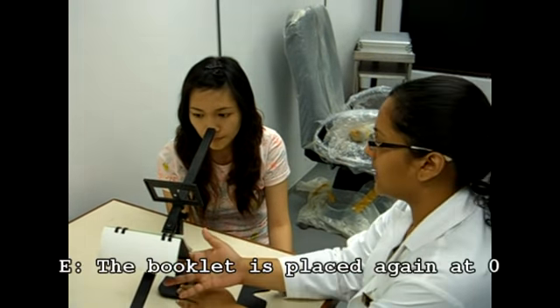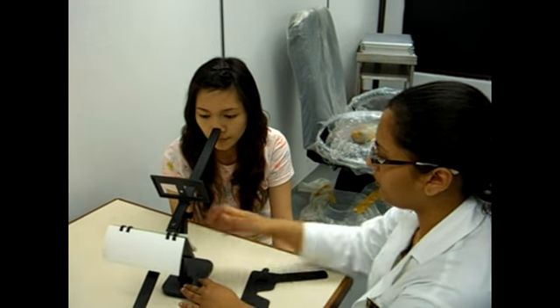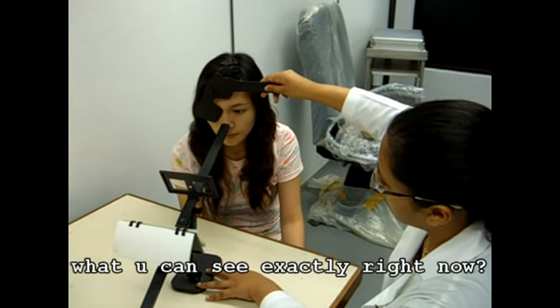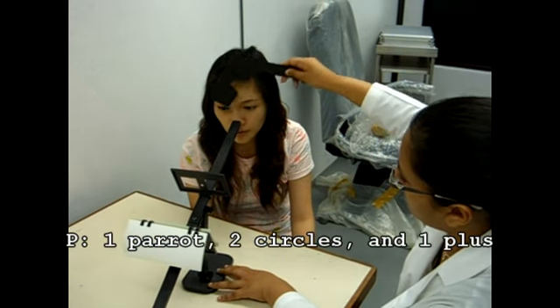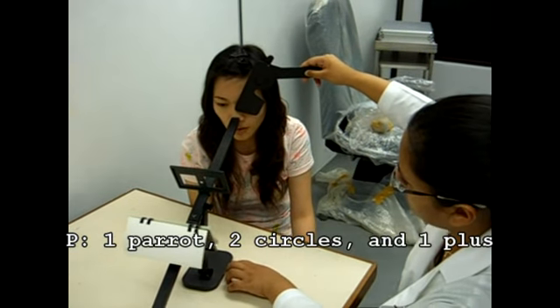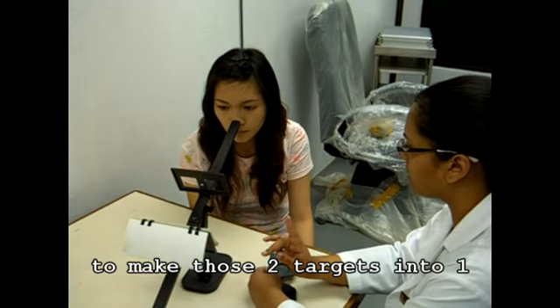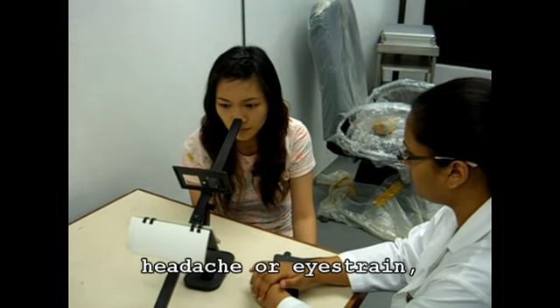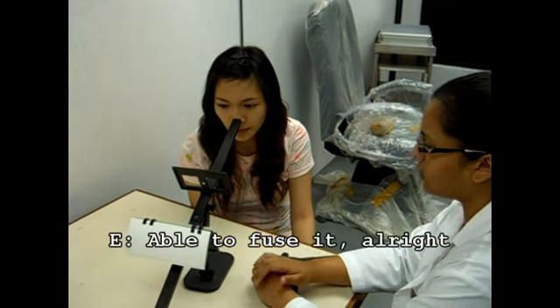The booklet is placed again at 0 and the aperture remains at 1 and 2. So again I'm going to ask you what you can see exactly right now. 1 parrot, 2 circles, and 1 dot. Alright. Another 1 parrot, 2 circles, and 1 plus. So I'm going to ask you to try to make those 2 targets into one. If you feel any kind of headache or eye strain, just let me know. Okay, already fused into one. Able to fuse it, alright.